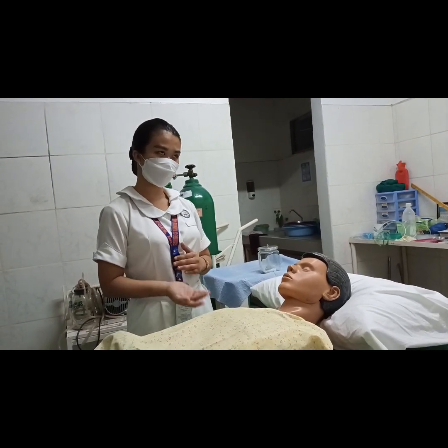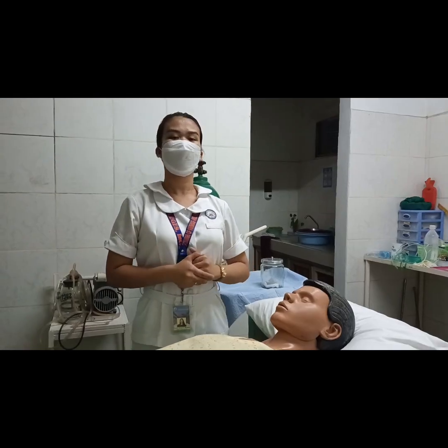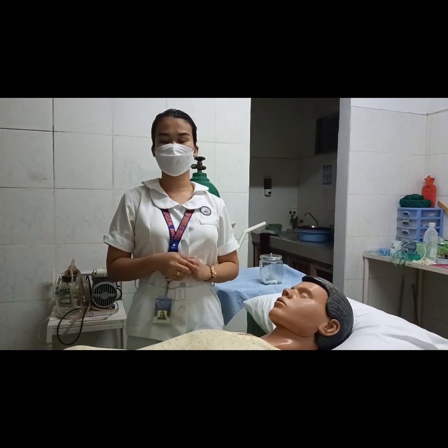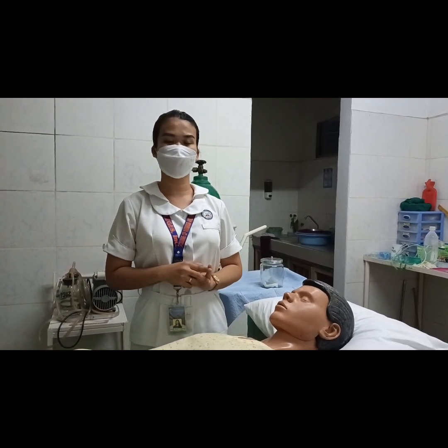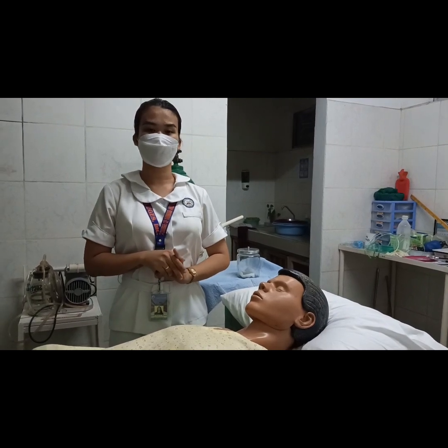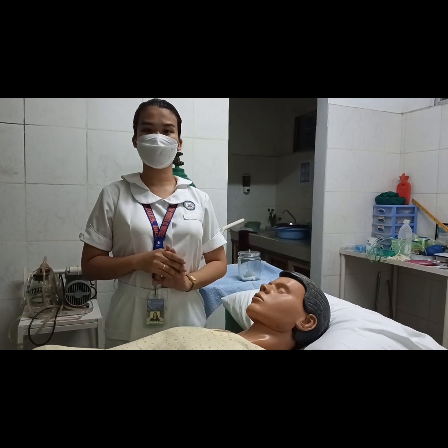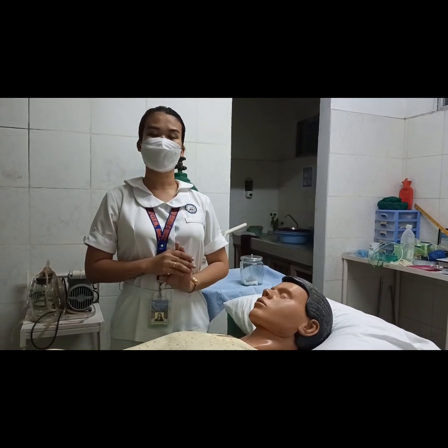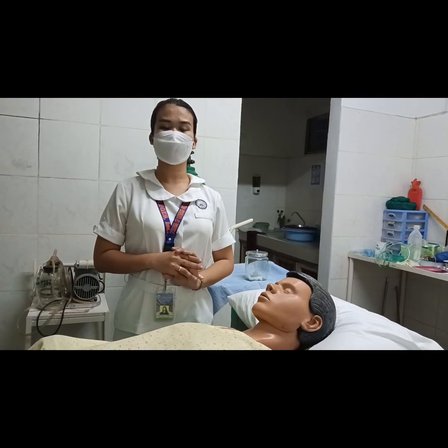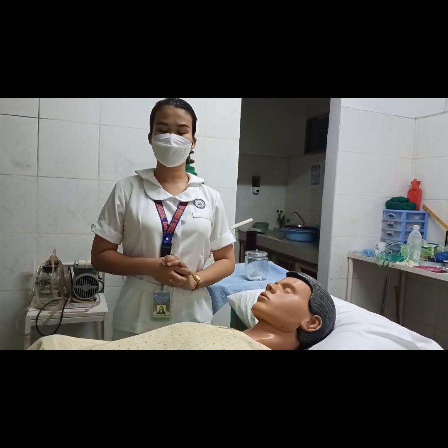For documentation: record the date and time of oxygen administration and method of delivery; record the flow rate and route of administration; record the immediate response to oxygen therapy, including subjective and objective observations of the client; and lastly, record the client's comfort with oxygen use.